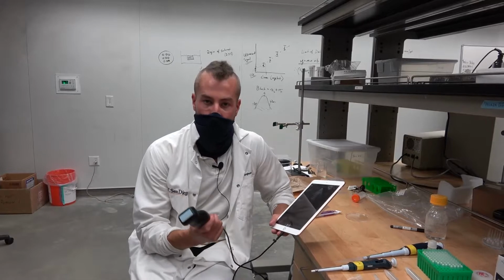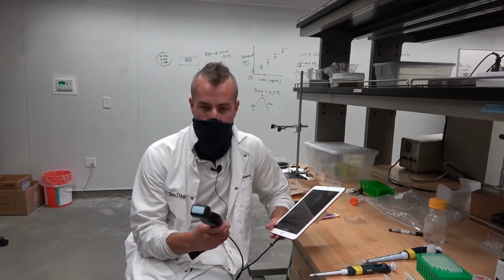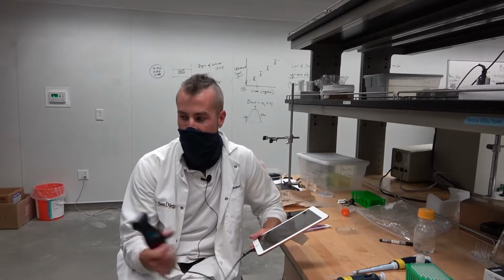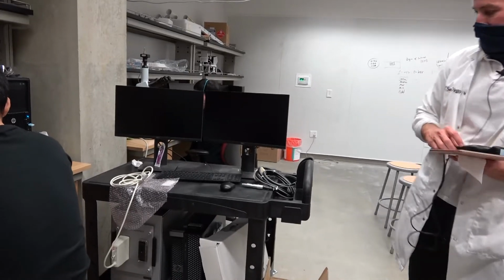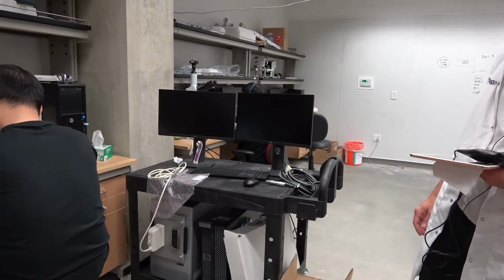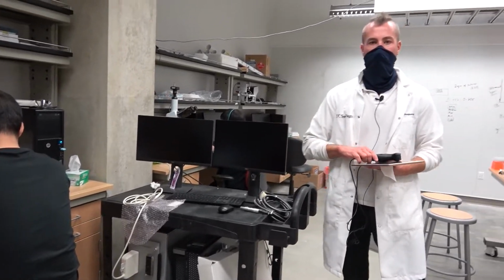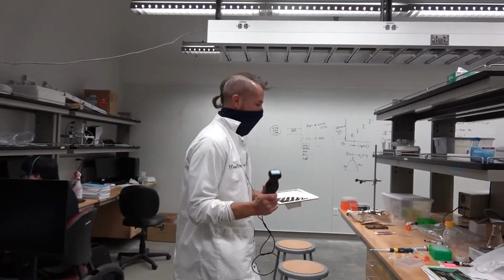This company is called Butterfly, if you want to read about them online. My student Yash was just telling me that they're going to go public in a few years, and I can see why. They're just a really great technology. Next to me is a research grade ultrasound system, and you can appreciate just how big it is. The ones used in the hospital are about this size, maybe in slightly nicer packaging, but compare that to this, and I think you really appreciate the value.